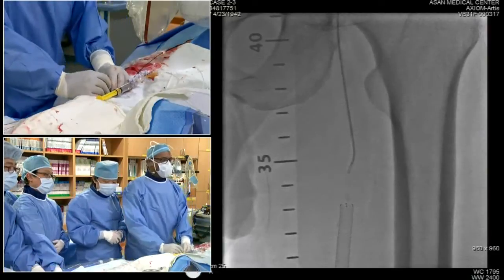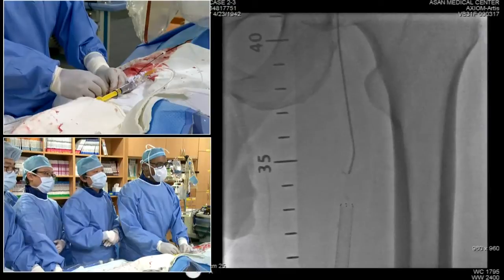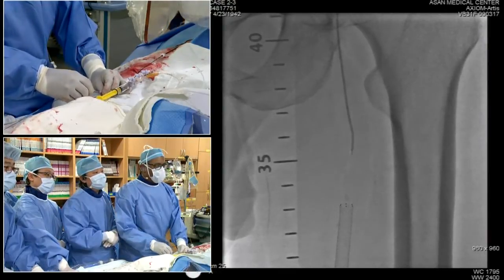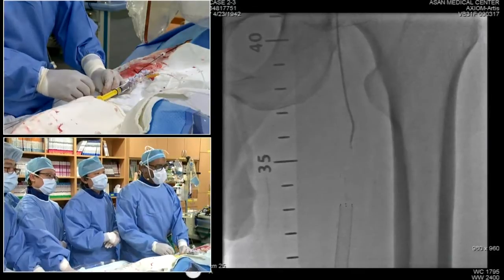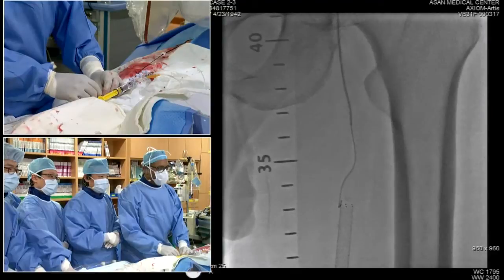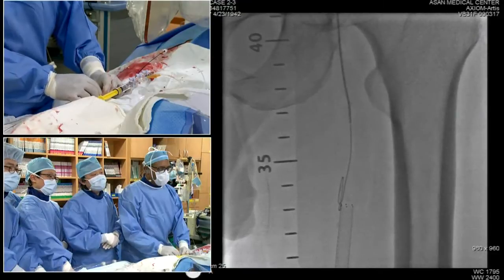I think a technique, almost like a reentry technique, to try and get from this false lumen to the same lumen as the stent would be a possibility with a curved catheter and a stiff wire. The other possibility, which I think everyone on the panel likes, would be to do a direct puncture of the stent and go retrograde.